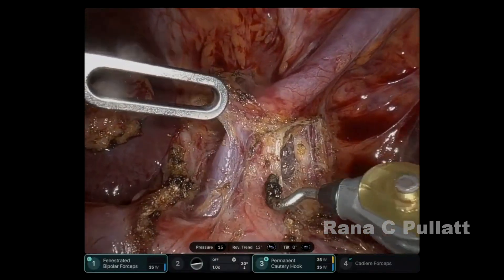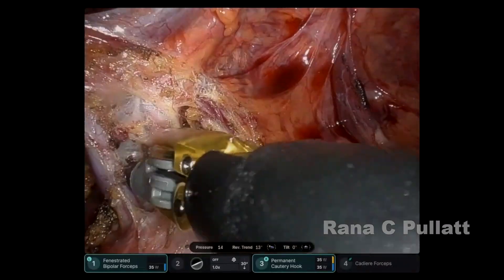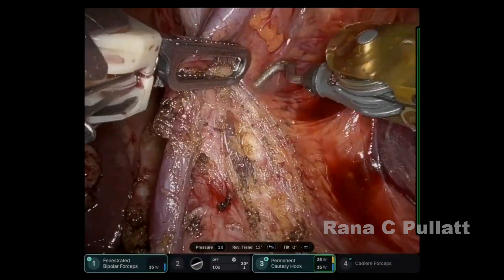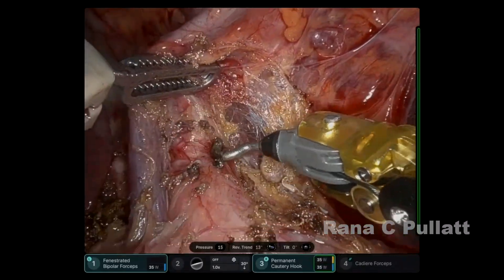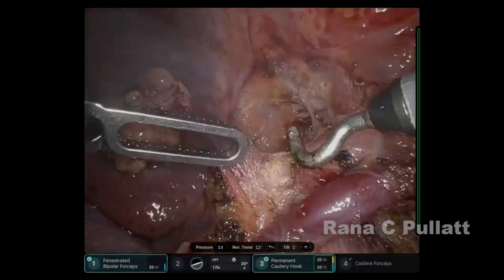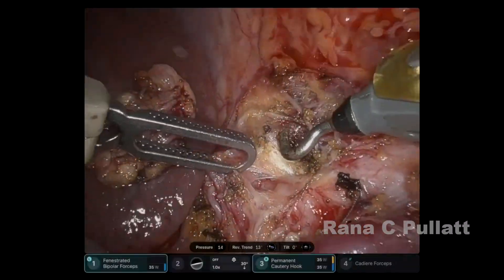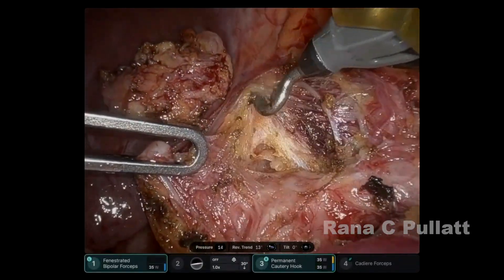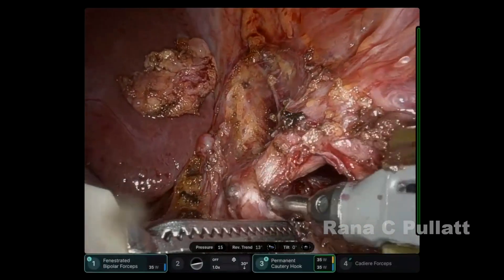The left gastric vein is then dissected progressively and a window is made. The left gastric artery is identified and tissue surrounding it is then dissected. It's important to remove all of the nerve tissue around this area, as the celiac ganglion is also considered a cause of the pain. The celiac ganglion can be seen coming into view, wrapping around the celiac artery.